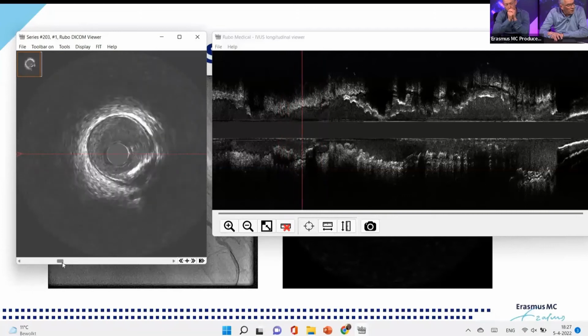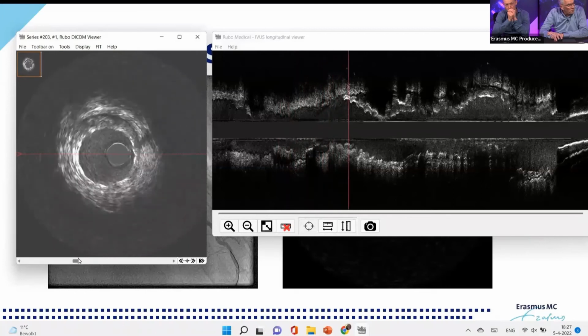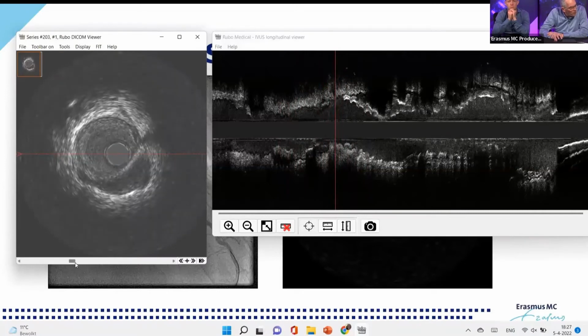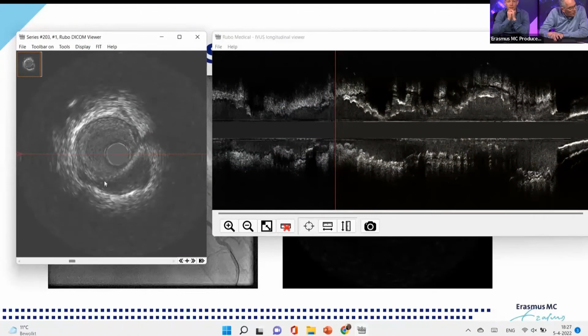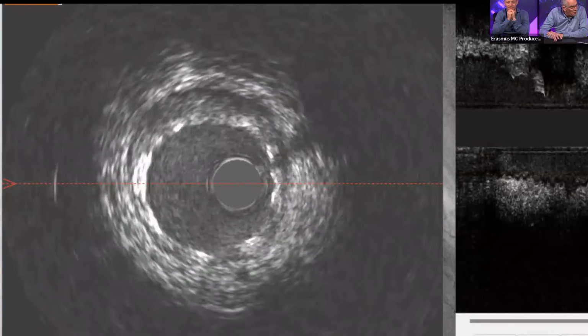Now we see also here that the vessel is, of course, diseased. The lumen is bigger. And here we have our stent. And what we also see at the stent, and we were discussing this a bit also with my colleague Karen, what do we see here? It's just distal from the stent. And in the end, we decided after some discussion that indeed there must be a hematoma here outside. We were even thinking, well, are we looking at the vein? But I doubt it a bit because of the shape.